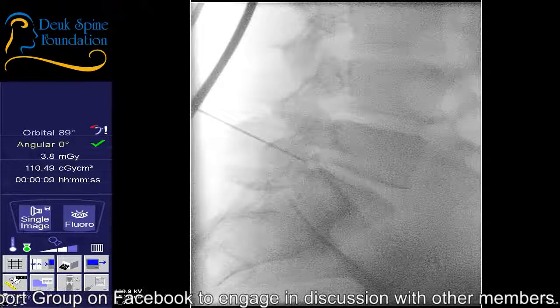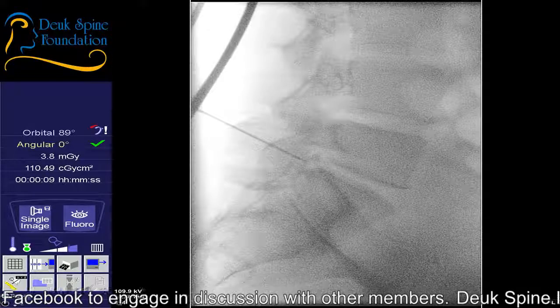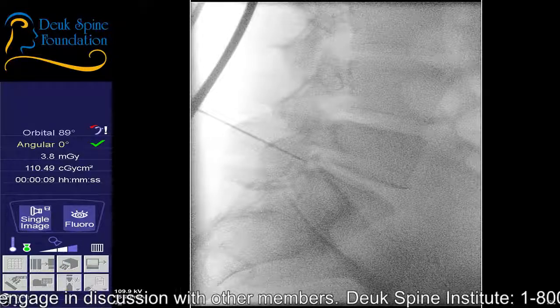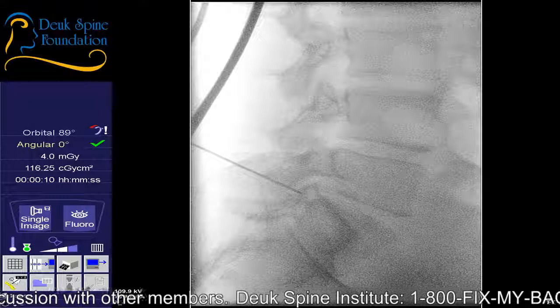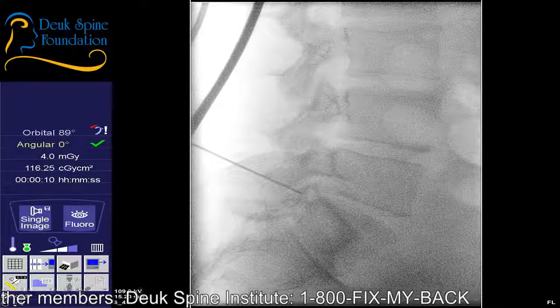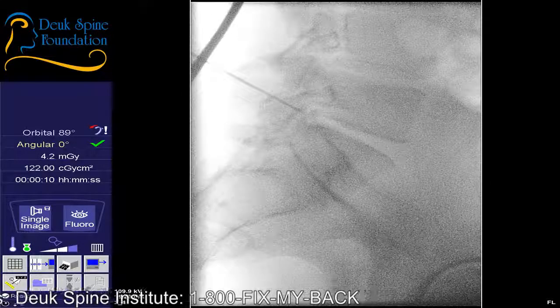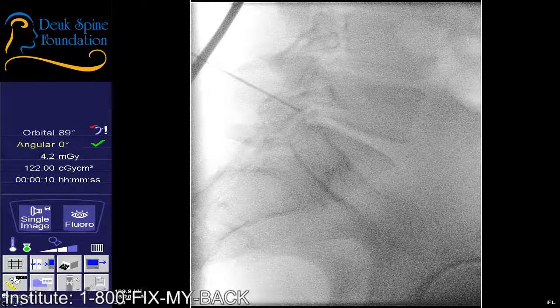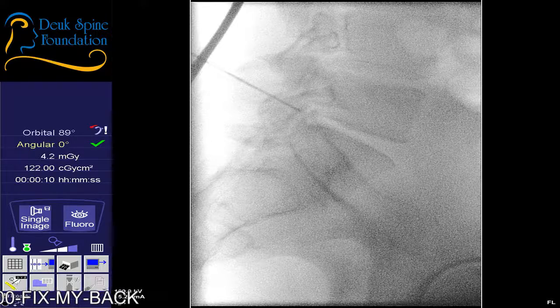Jordan, that's close. Let's try a little more wag. Are they in the area that's bothering you? I think that's worse. That's better. That's better. I can see down the disc now. All right.